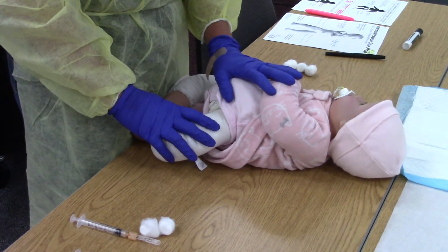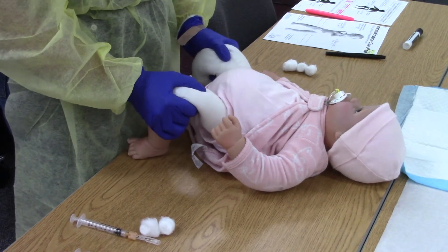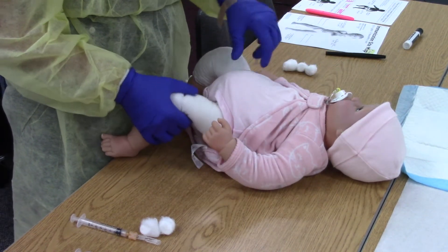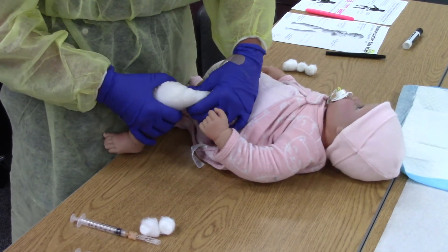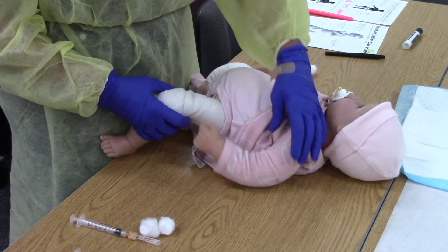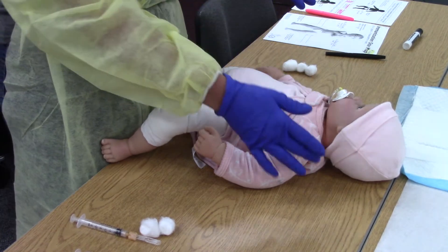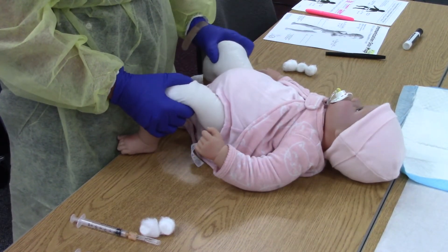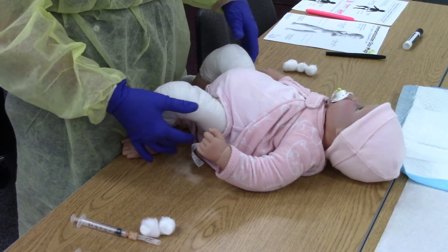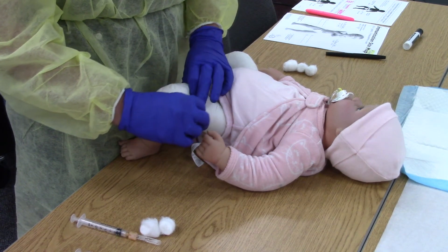Generally, you can give intramuscular injections in the thigh until they walk, then switch to the deltoid. It depends on muscle mass — you want to inject where they have the most. We don't usually aspirate on babies. They won't have adequate deltoid muscle mass until approximately two years old, depending on size. For infants, we use the vastus lateralis, also called the anterolateral thigh — the front lateral thigh area.